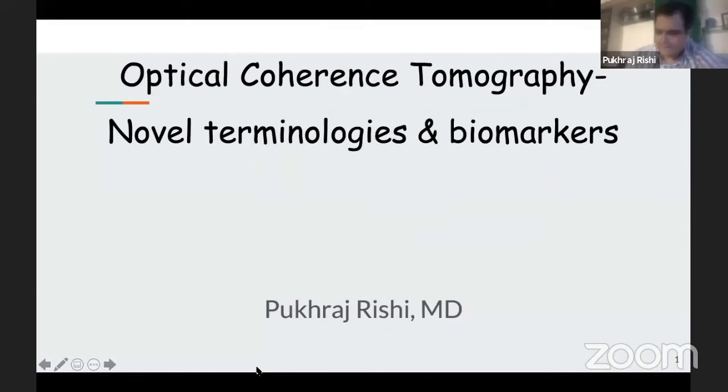Thank you, Anand. I hope I'm audible, and I'll be speaking on OCT, novel terminologies and biomarkers.